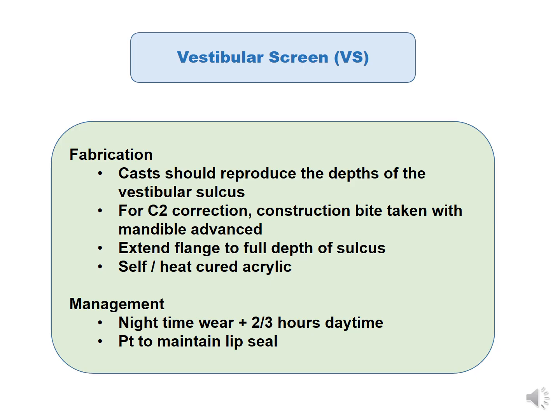The flange is extended to the full depth of the sulcus, and the screen can be made from either self-cured or heat-cured acrylic. The patient is expected to wear the appliance full night time and about 2 to 3 hours daytime, and the patient is advised to maintain lip seal while using the appliance.